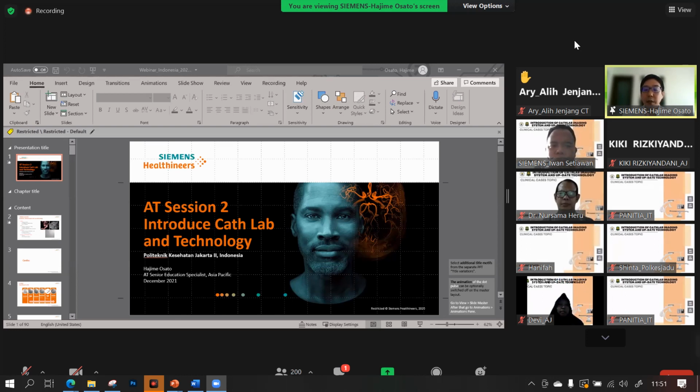For example, if we use the isocenter calibration for a certain image and the object shifts from the isocenter by 1 centimeter, we include about a 1.5% error.